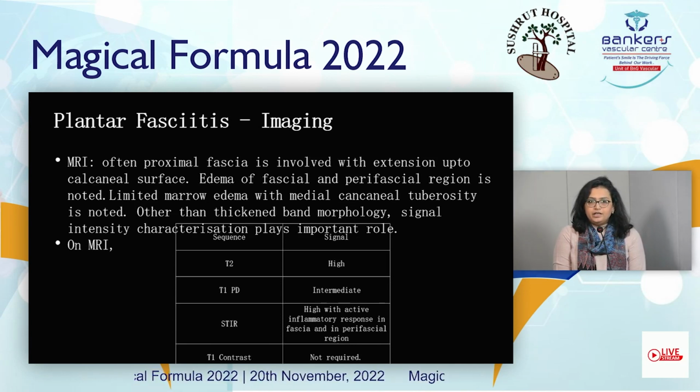On MR, we can identify the edematous changes in the plantar fascia, as well as some marrow edema that may be associated in the calcaneum at the site of its attachment, or there may be an inferior calcaneal spur that can be identified on MR.